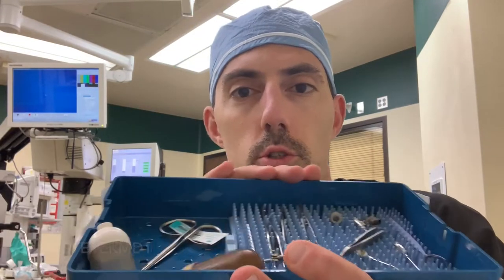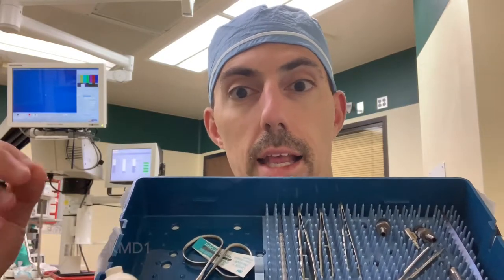Good afternoon, everybody. It is Dr. K here from the Eye Institute, and we are just in OR2 at the Eye Institute. What I wanted to do today was go over surgical instruments — the instruments that we use during cataract surgery — really highlighting exactly what they are and what they look like.